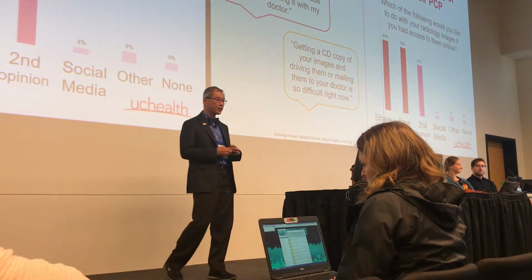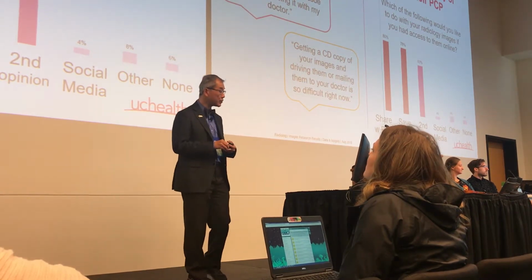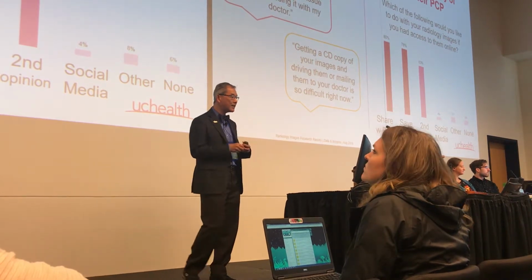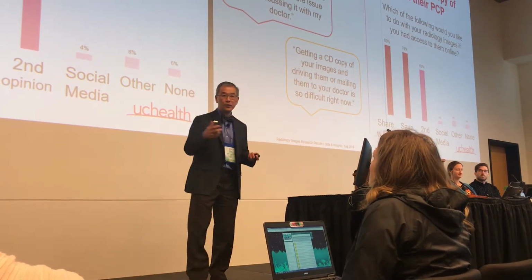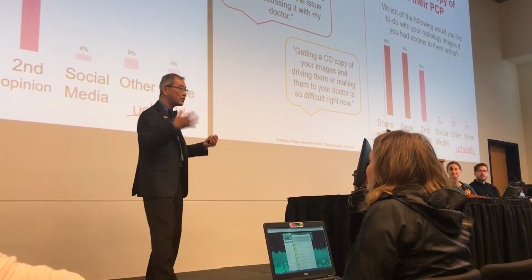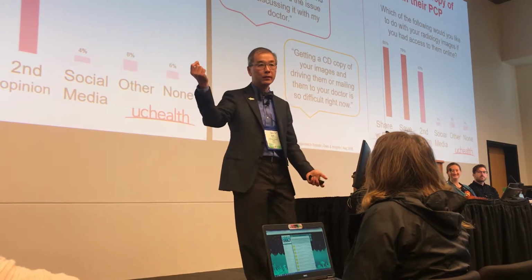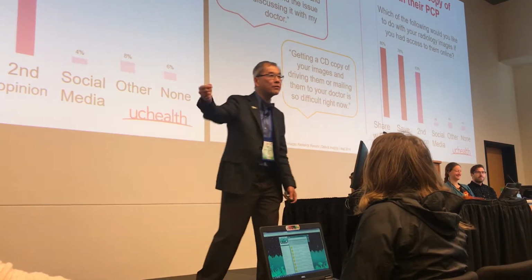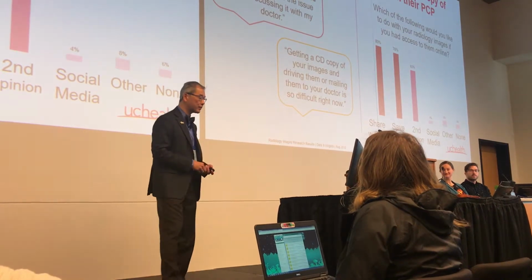If given access, patients would save a copy of images and share them with their PCP. I would have the opportunity to see the images myself and better understand the issue and discussing it with my doctor. And here's the quote, getting a CD copy of your images and driving them or mailing them to your doctor is so difficult right now. And just to add to that, right, as we purchase new PCs, none of them have CD drives. So even when patients go, look, I went through all the trouble of bringing you this CD, and you go, I can't do anything with this. I don't have a drive in my office. Can you now drive this to our medical records radiology department, have them scan it in, and maybe in a couple of days I can view it on our network? Really kind of a troublesome issue.